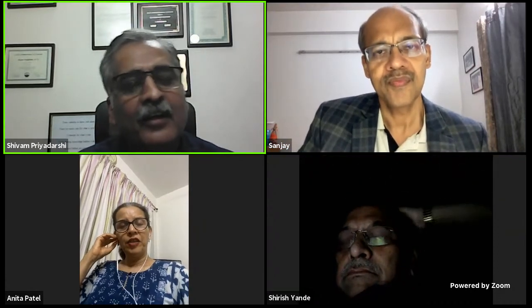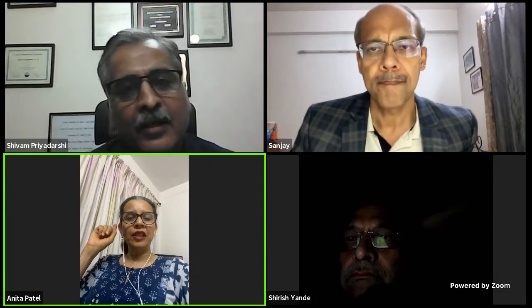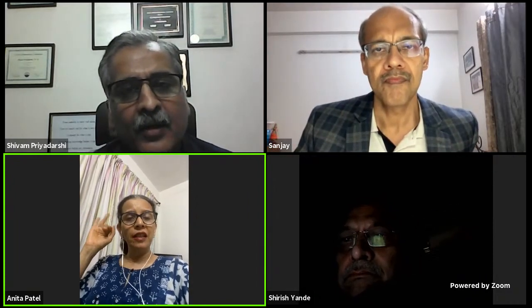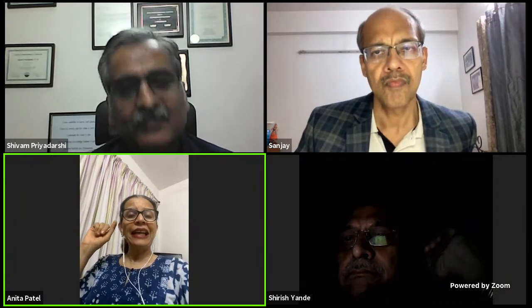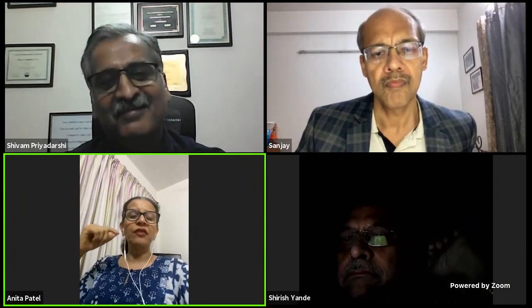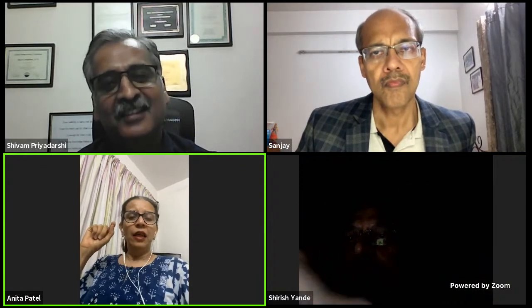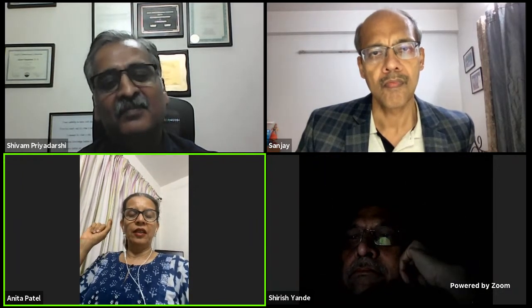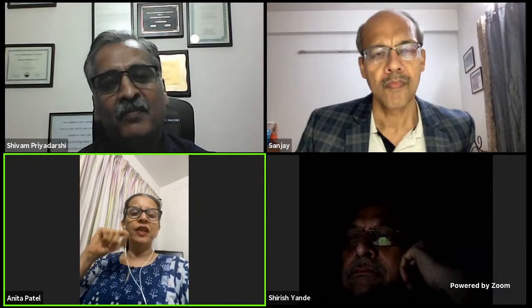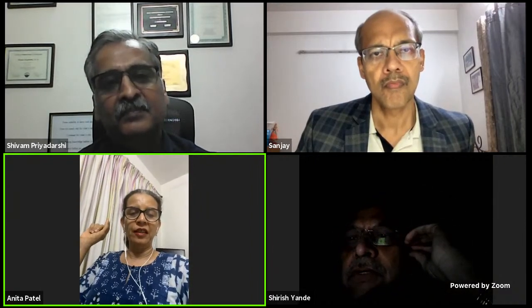Dr. Shivam, can I just add something? Yes, please. There's a tendency to say that this is an invasive test, it's an expensive test, we don't have it available at our place, and hence there is a justification for not doing it. But then, urodynamics is far cheaper than doing a wrong surgery. Urodynamics is far less invasive than operating on somebody when it is not indicated.